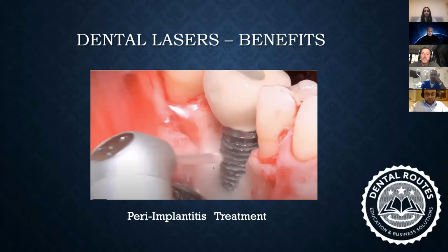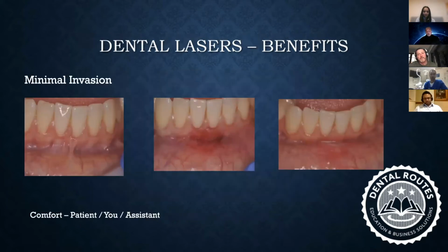And that is where, again, the erbium YAG laser, this laser that I use, is the most preferred laser of all the lasers that is there in the market when it comes to completely decontaminating your implant surface. It does it to the T. You can augment the bone at the same stage and cover everything up, and the healing is fantastic. So we have covered almost all these aspects of the surgical stage, the second stage surgery, and complications of dental implants, and that is how you can use them in different ways when you're placing implants.